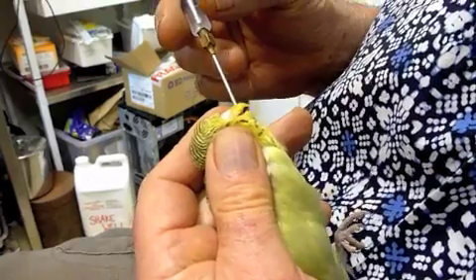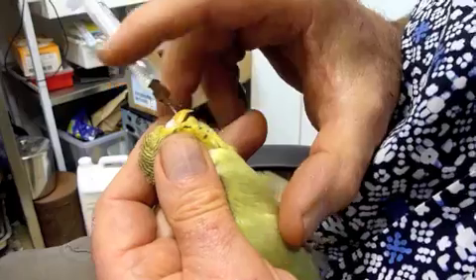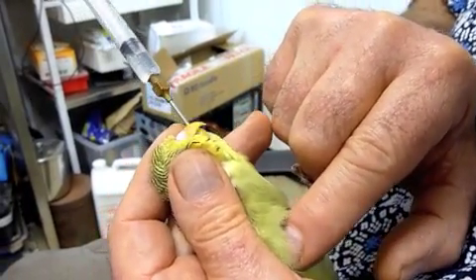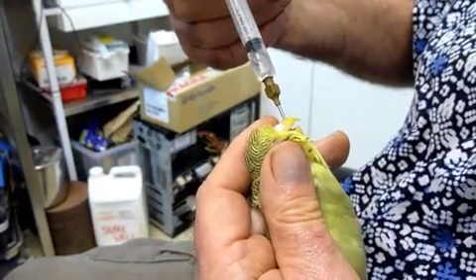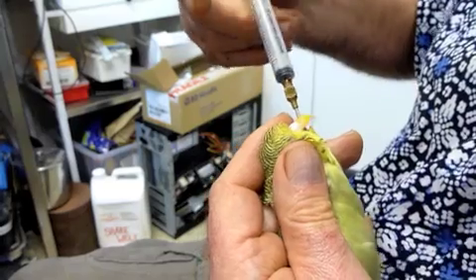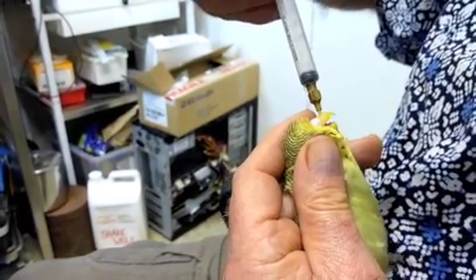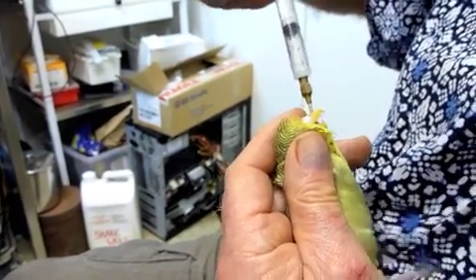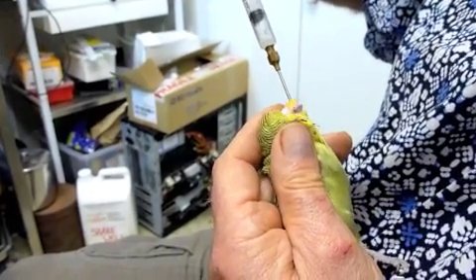Just easing it in — there's no force here, just sliding without force. I can feel the end of the needle, so I can push there, and you can see the syringe going back up. I know I'm in the right spot. Syringing in the water with the body upright — this is not comfortable for her, but I'll do it as quickly as I can. We're just flushing back and forth and hopefully we'll get a small sample. Just quietly — there we are.